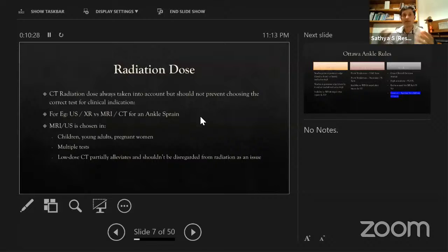because you need to understand what the problem is that you're dealing with, whether it is a complete fracture or just a stress fracture, or are there some other structures involved, is there a dysfunction happening, or is there dysfunction during movement. And you can go for movement related or 4D related CT scans also. We must be able to choose the right test.